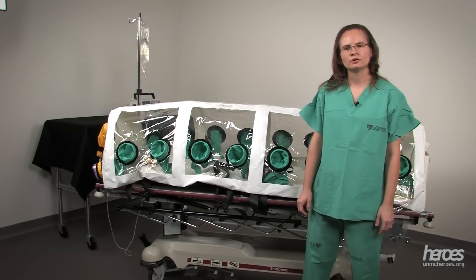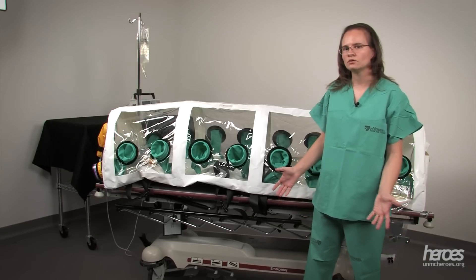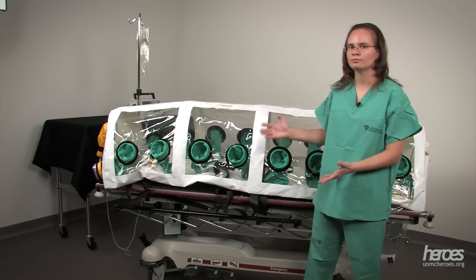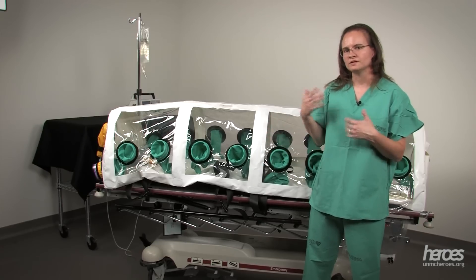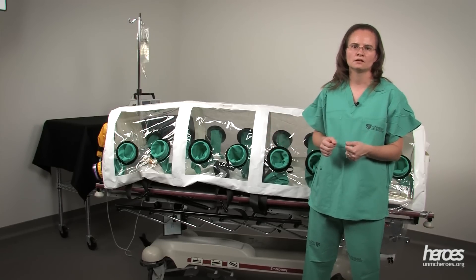The isopod is a helpful tool to transfer a patient with a highly infectious disease. This is a tool that we don't use often, so it's important to practice with your isopod to maintain competence. We hope this video will help you to assemble your isopod for maintenance and clinical use.